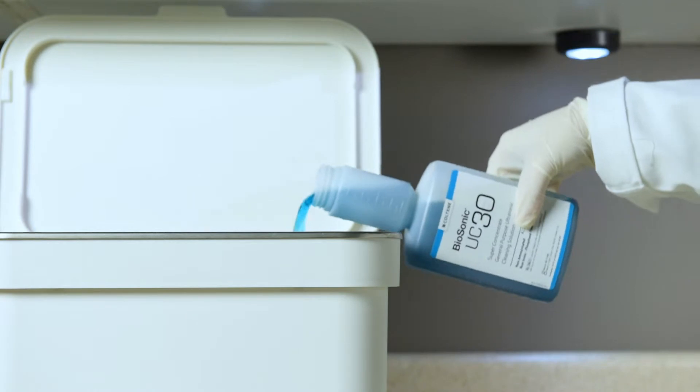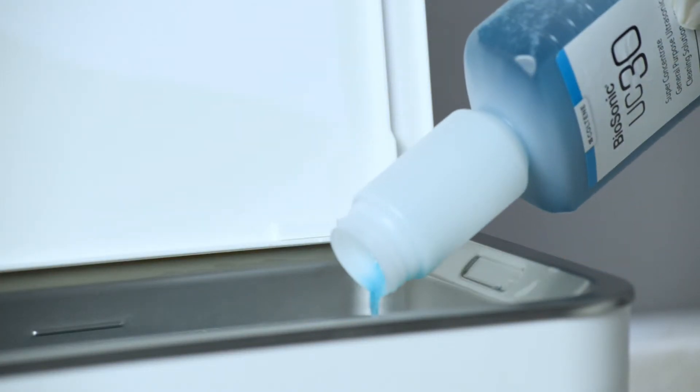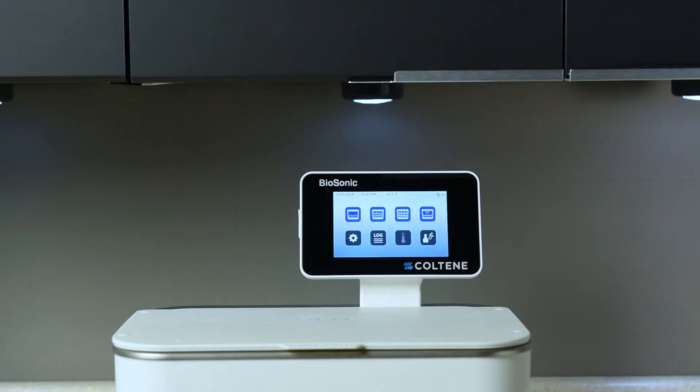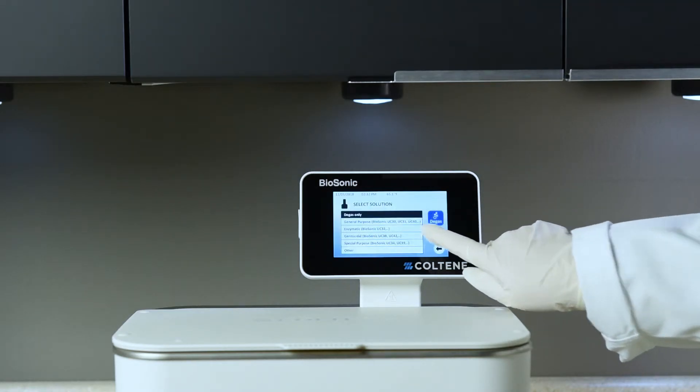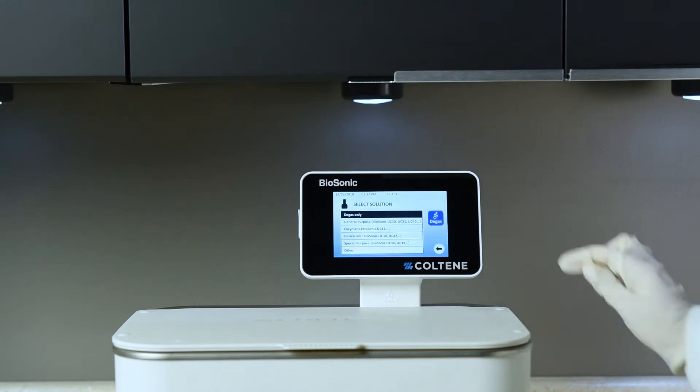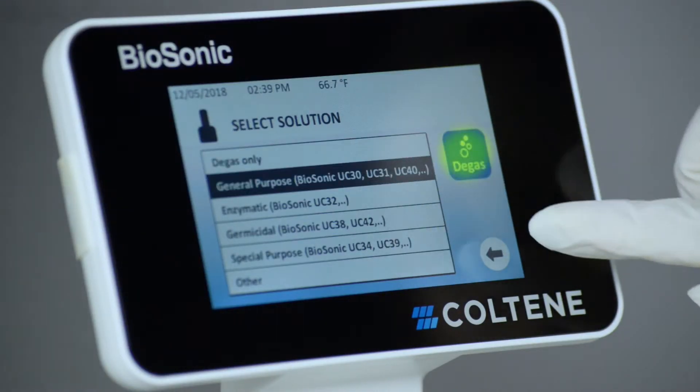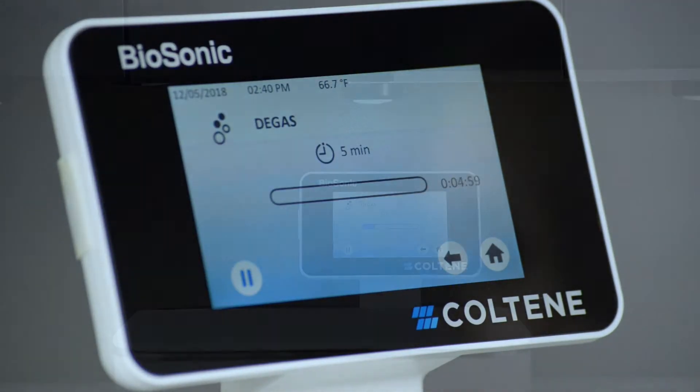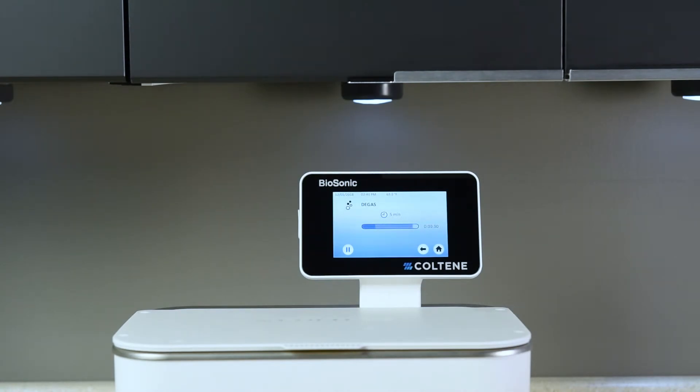Degassing is necessary each time a new solution is added to the tank. Your biosonic unit is equipped with a degas cycle that prepares your solution for use. Simply press the degas icon on the main screen, select solution type and press the degas icon to start the degassing process. The timer will count down from 5 minutes.